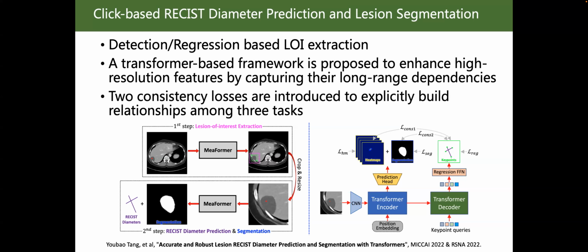This figure shows the overview of the proposed method. Given a CT image and a click guidance, the red spot within a lesion, the top left and bottom right corners, the green circles, show a bounding box. The bounding box, shown as the green dotted box, is predicted to indicate the lesion region at the first step. Then a lesion of interest region in the bounding box is extracted.